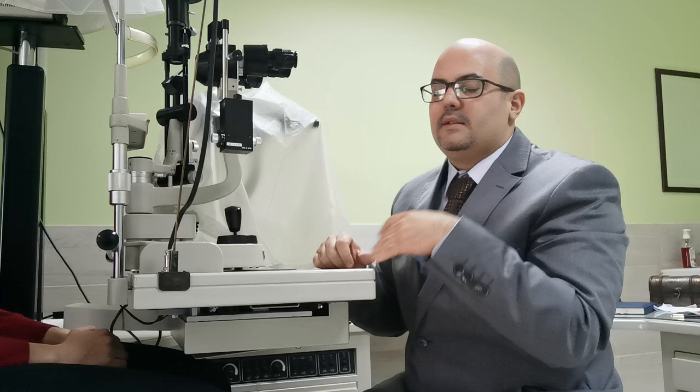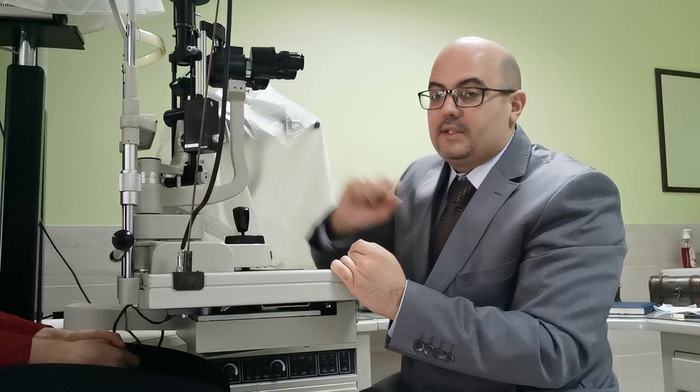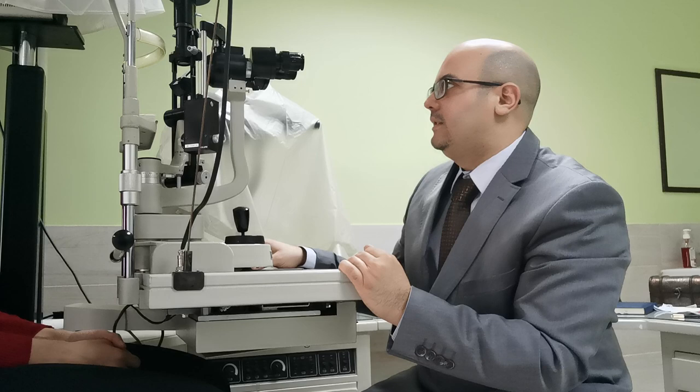So you can magnify things 10 times, 16 times, or even 40 times magnification. There are some add-on pieces that come with the slit lamp. One of them is the Goldman Tonometry — we will have a separate discussion on that. You can also have hand-held lenses, such as this 90-diopter lens, which are used to visualize the back of the eye, mainly the optic nerve and the retina.